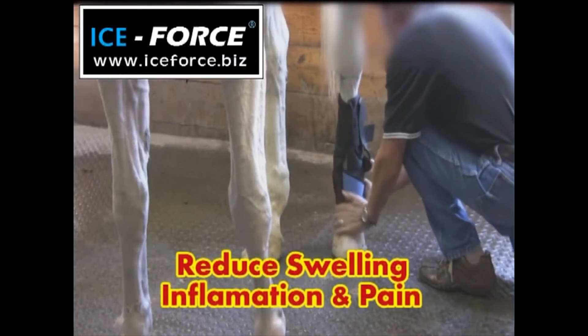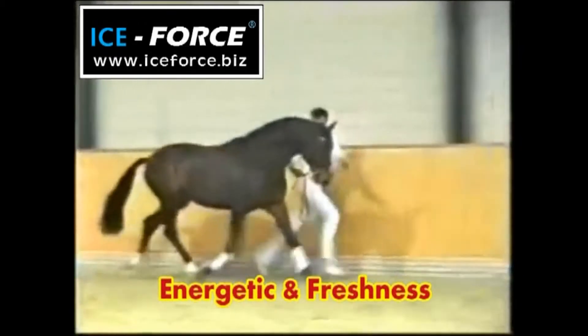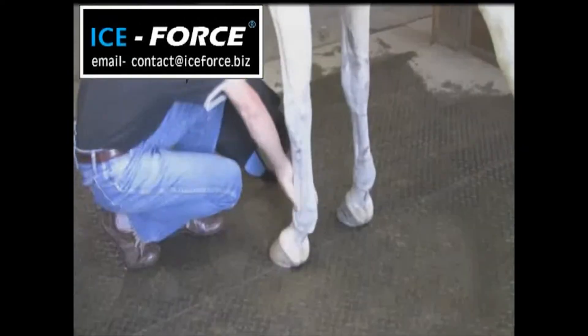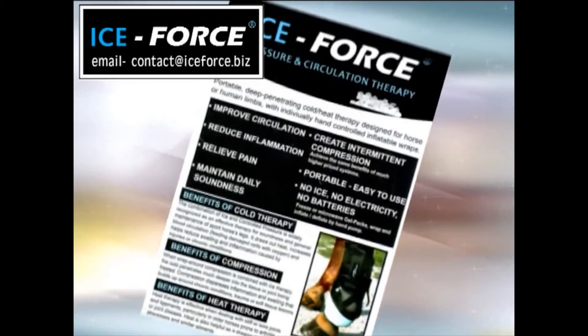Our eco-friendly Ice Force Boots reduce swelling and pain by increasing blood circulation and healing. It helps to keep your horse fresh, fit, and energetic. The Ice Force Boots are also useful for injuries, and the results will surprise you.